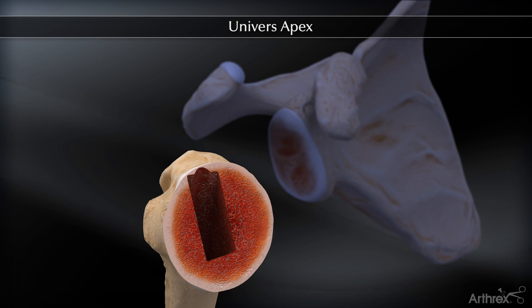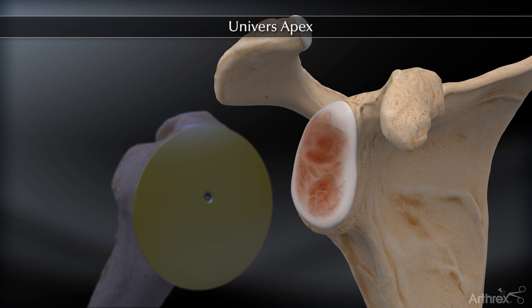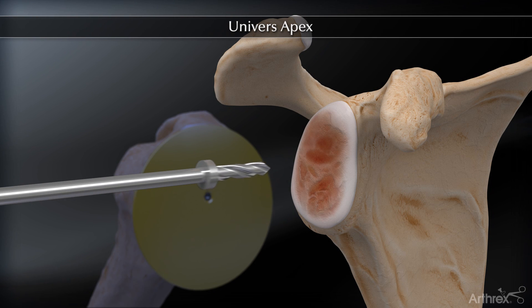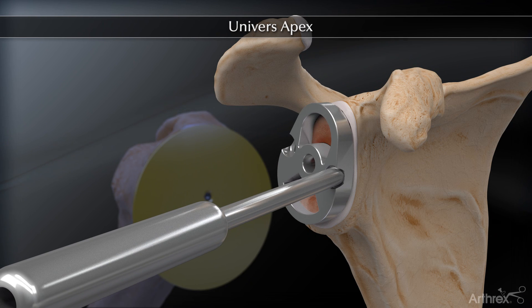Following canal preparation, a proximal humerus protector is placed and attention is turned to glenoid preparation. A pegged and keeled glenoid option is available. The pegged option is demonstrated here. The center of the glenoid is first marked by placing a small defect, followed by positioning the central peg guide and drilling the central peg hole.